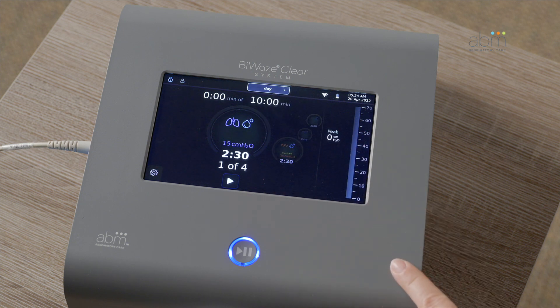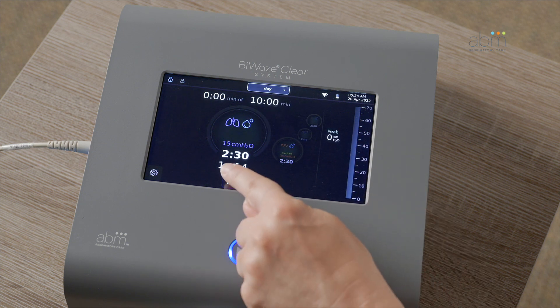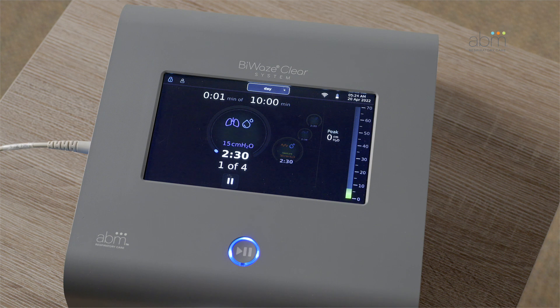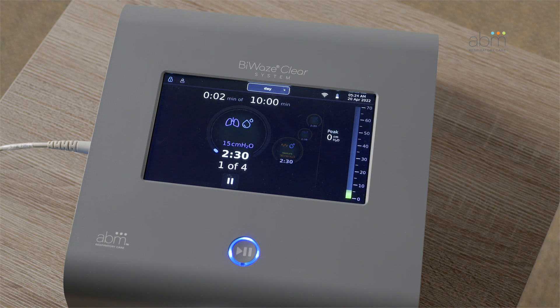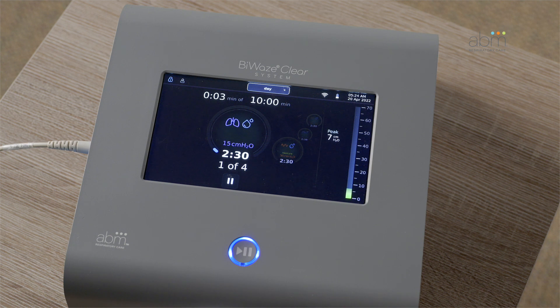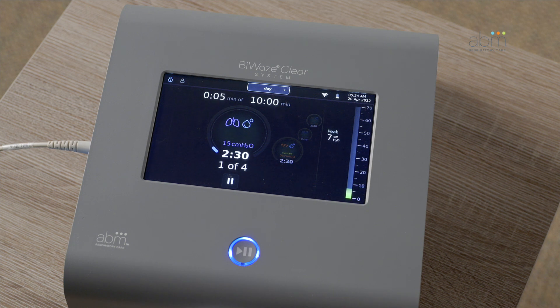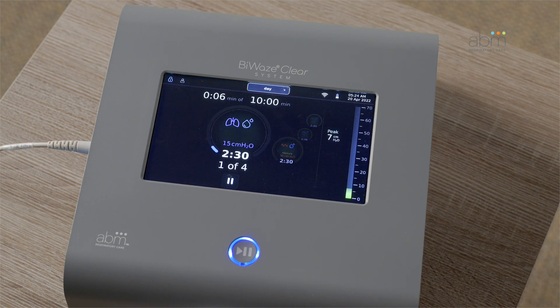Once the correct therapy profile is selected, press the Start button on the bottom of the screen. BiWaze Clear will deliver the therapy continuously until the therapy is completed.